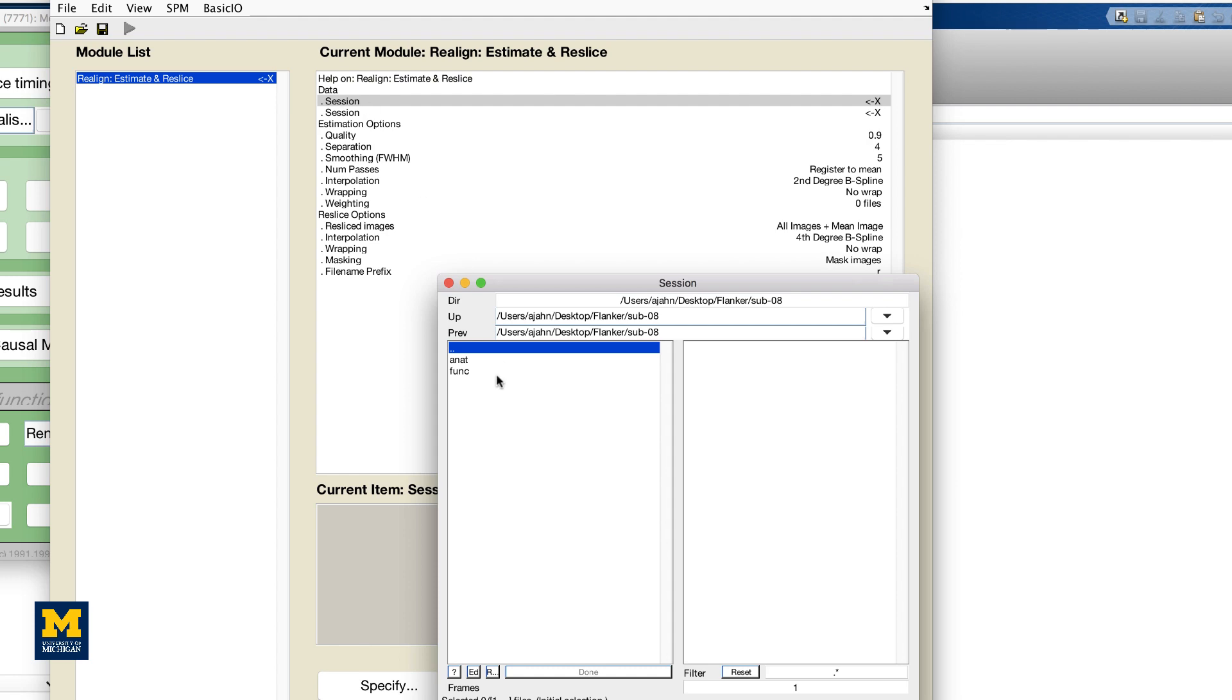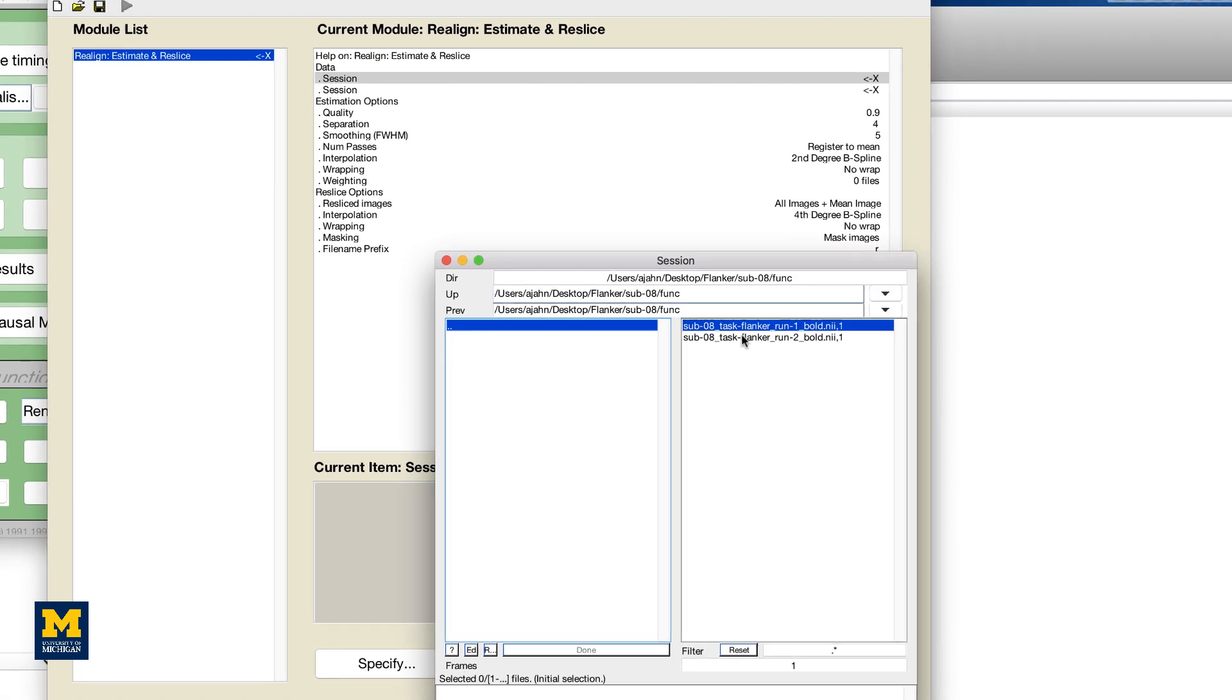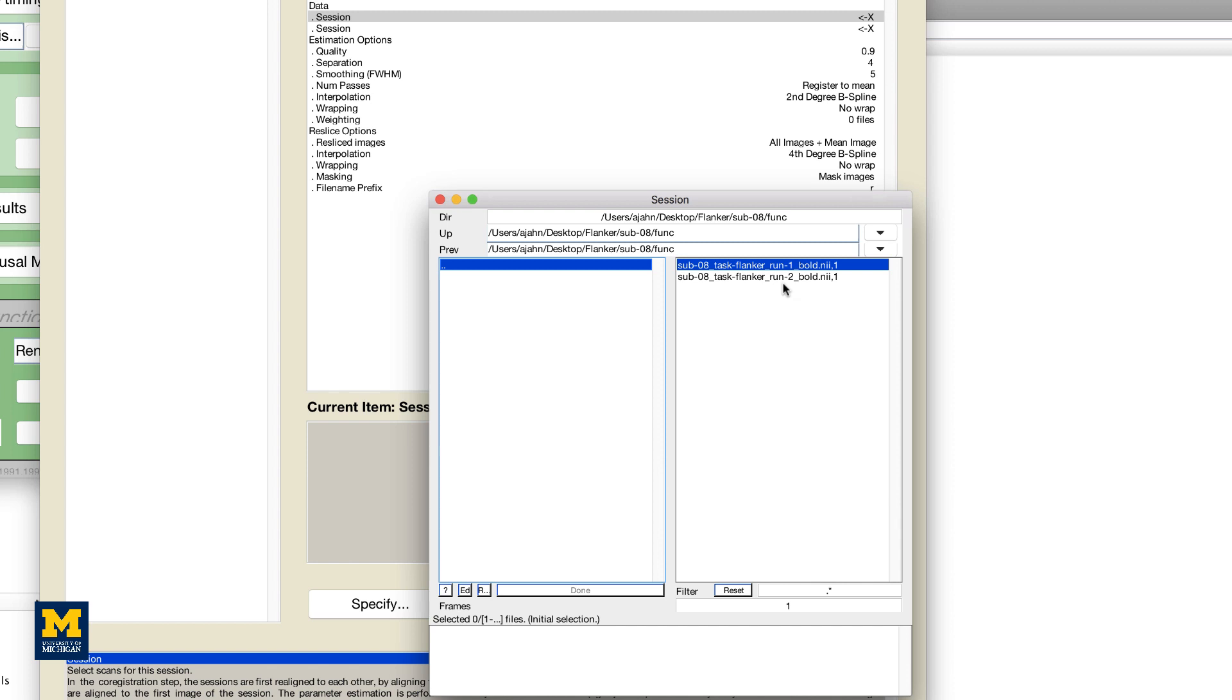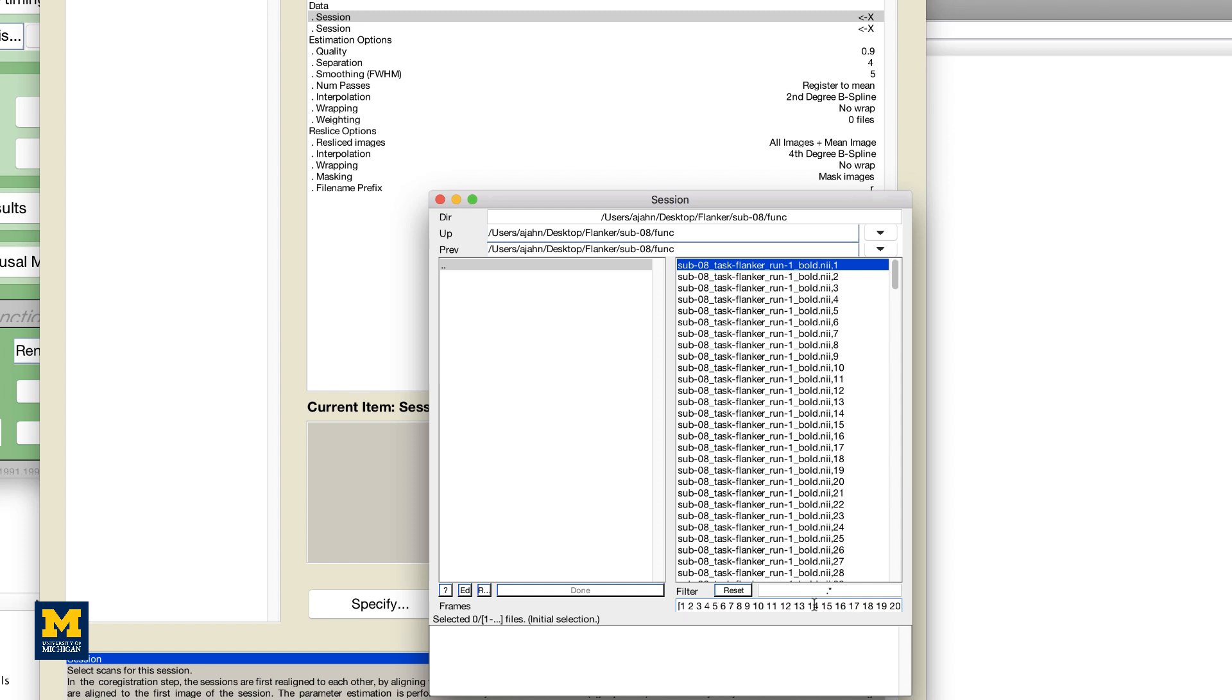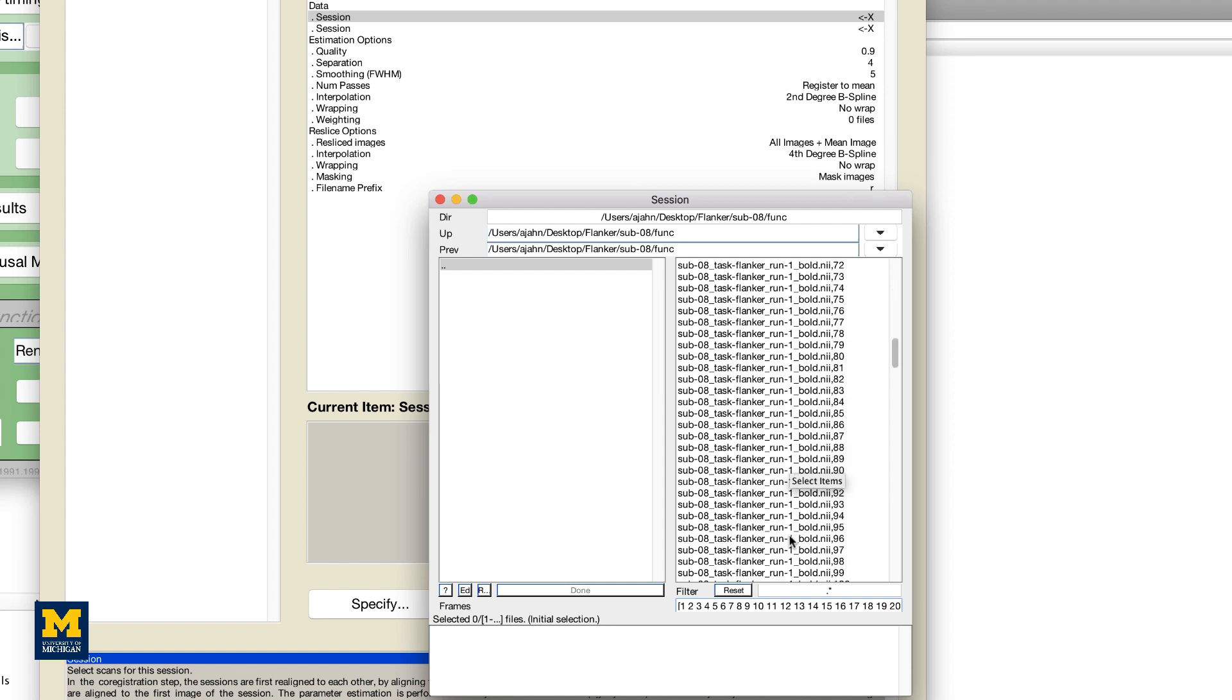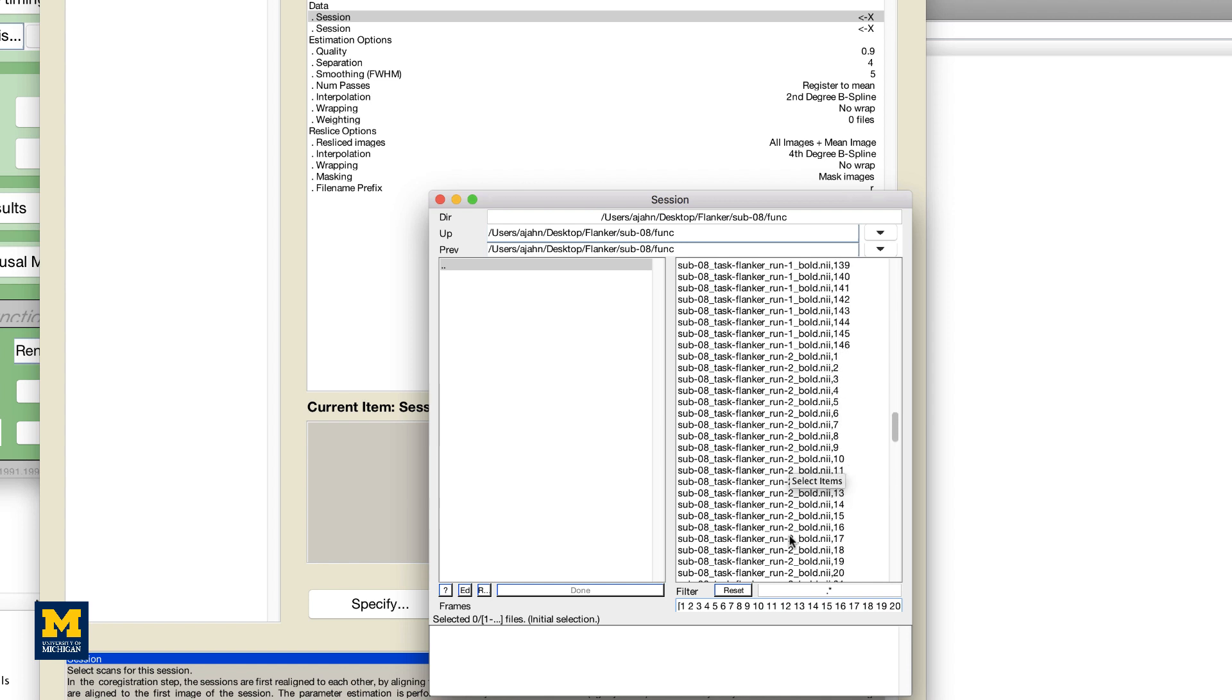Navigate to the func directory, and note that there are two files within that directory, Run1 and Run2. The comma 1 at the end of the file name indicates that only the first frame or volume is available for selection. In order to select all of the volumes for a specified run, we will need to expand the number of frames available for selection. In the frames field, underneath the filter field, type 1 colon 146 and then press Enter. However, you will notice that all of the frames for both Run1 and Run2 have been selected, even though we only want the frames for Run1. You could simply click and drag from frame 1 to frame 146 for Run1, but you risk accidentally including other frames by mistake.